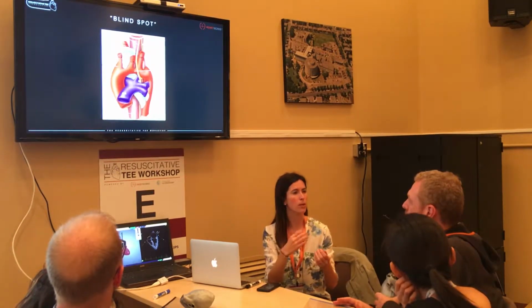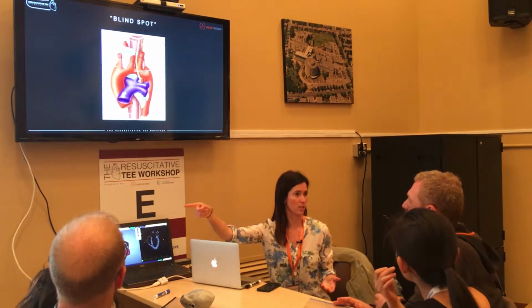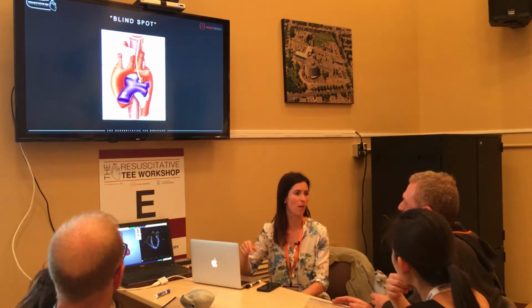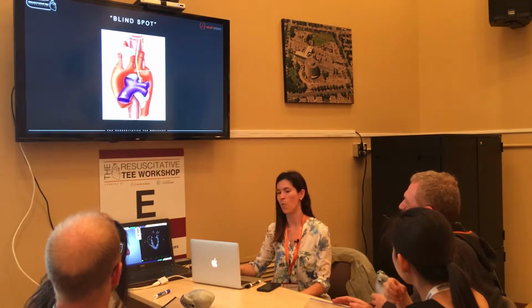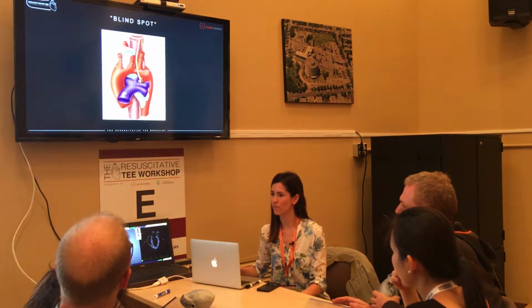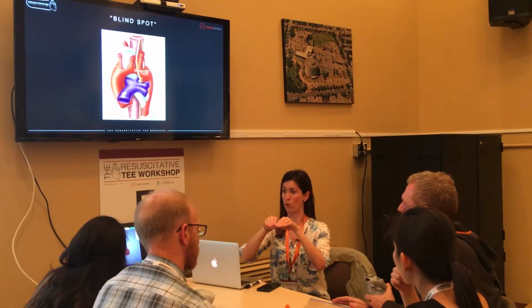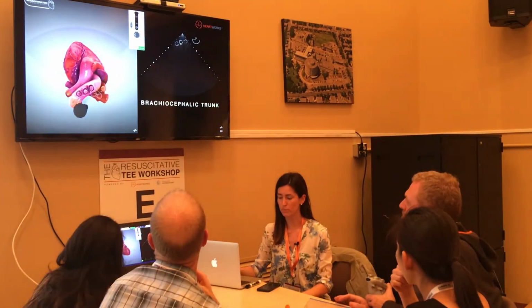As you advance the probe, it's going to get better. But where exactly you have the dropout depends on that patient's anatomy. You're not going to see that dropout in these simulators. It's going to be beautiful. You're going to see everything, okay? But be aware that this is a problem in a patient that is alive, or at least intubated with air going in and out of the trachea, okay? Mainly is the last part of ascending. So, yeah, right at the ascending aorta and at the lower edge of that aortic arch. So, yeah, you're going to get some dropout there.